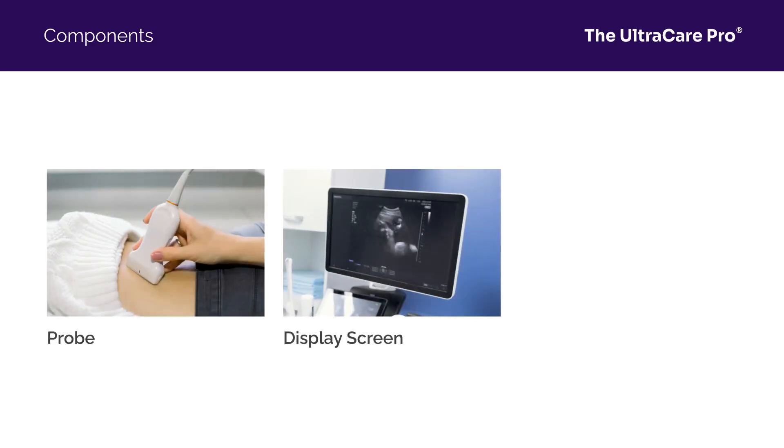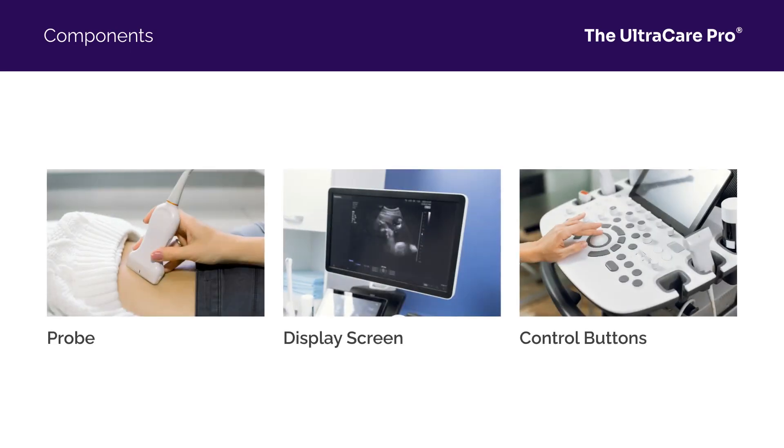Understanding the main components — the probe, the display screen, and the control buttons — will guide you in the cleaning process.